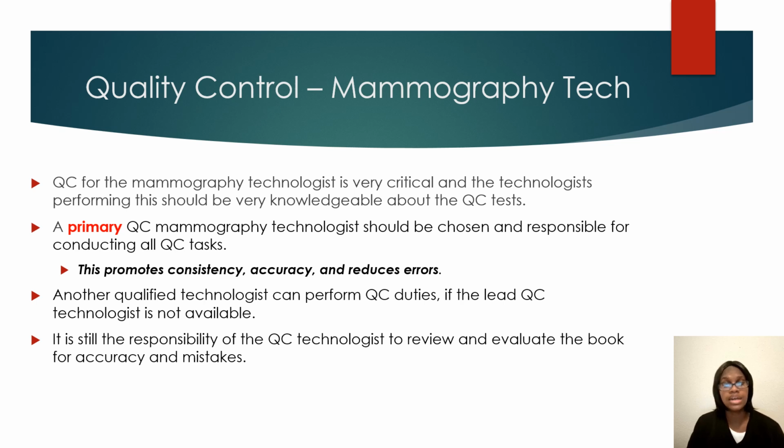QC for mammography technologists is very critical, it's very important. Most facilities let a lead QC tech do this, or multiple techs who are full time or who understand how to do QC, because you do not want everyone doing it if they don't understand it, if they don't know why they're doing it, what steps come next.